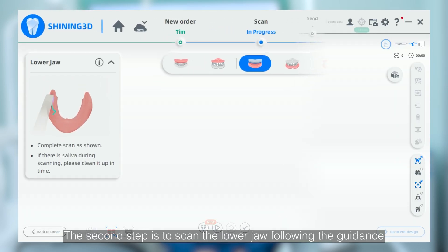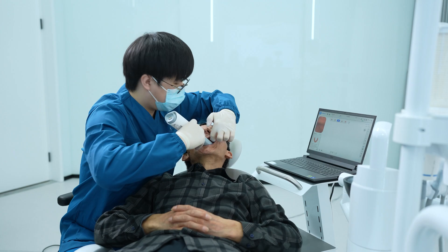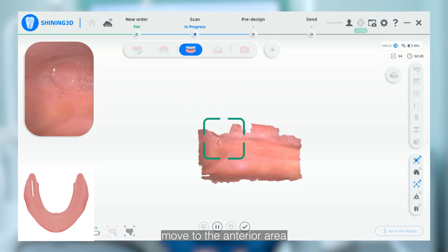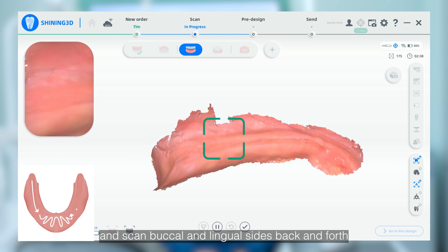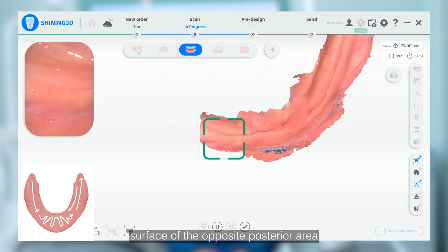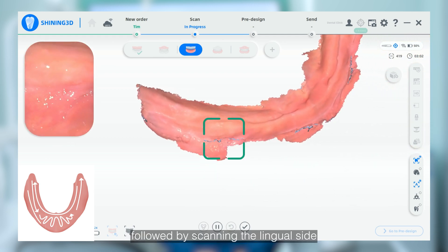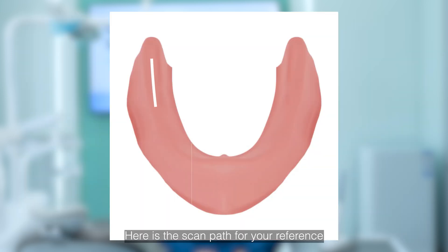The second step is to scan the lower jaw, following the guidance of the instructive video in the software. Start from the occlusal surface of one posterior area, move to the anterior area, and scan the buccal and lingual sides back and forth. Then proceed to the occlusal surface of the opposite posterior area, followed by scanning the lingual side. Finally, scan the buccal side. Here is the scan path for your reference.